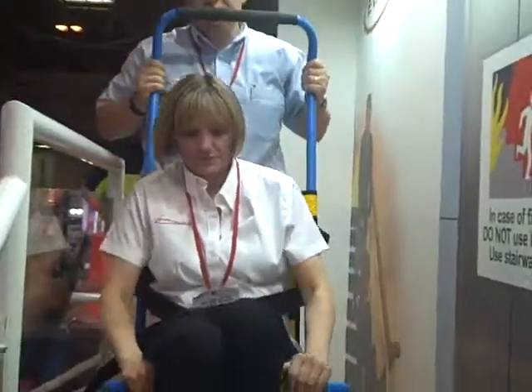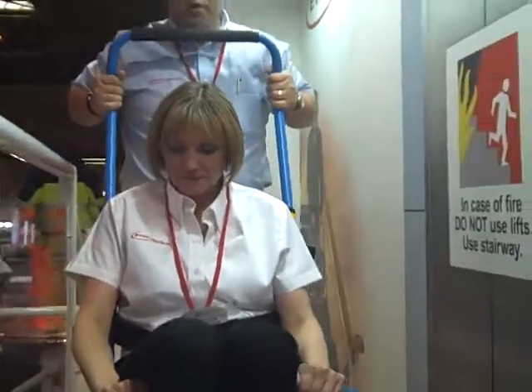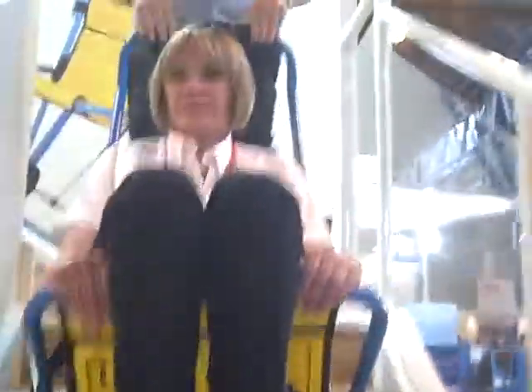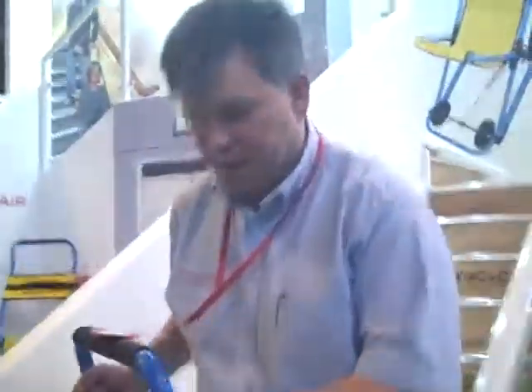Diane's now secured herself into the chair, and I'm going to begin my descent. A nice big push, tilt the chair back slightly, secure the chair to the stairs. As I stand on the handle, I'm now going to turn the chair around the landing. And once again, commence my descent. All the way down the stairs, the entire process should be entirely effortless.